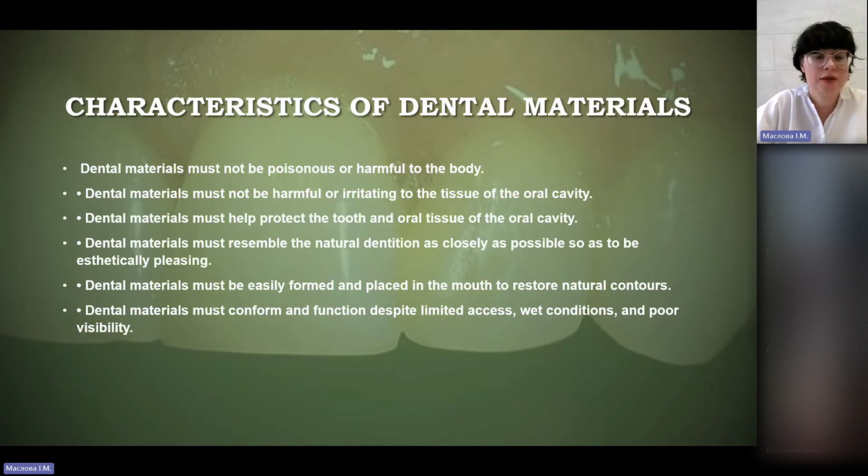Several minimally invasive preparation and restorative techniques have been advocated. Preservation of natural tooth structure should be the guiding factor for the smallest as well as the largest cavity. Cavity preparation design and restorative material selection depend on the occlusal load and wear factors. Tunnel techniques, proximal only box, slot, abrasion, laser, allow accessing the caries dentine from the occlusal surface while preserving the marginal ridge, for low susceptibility caries index.